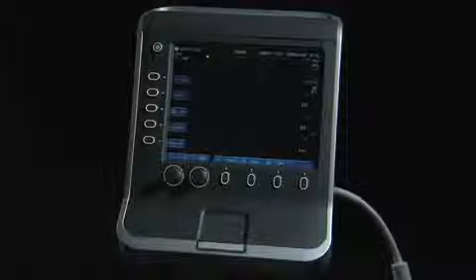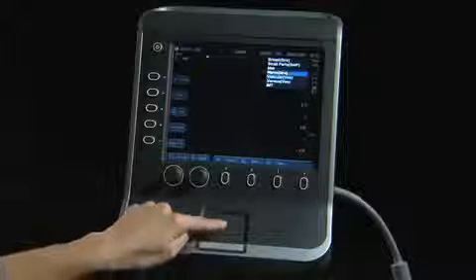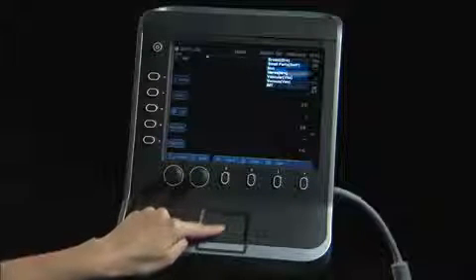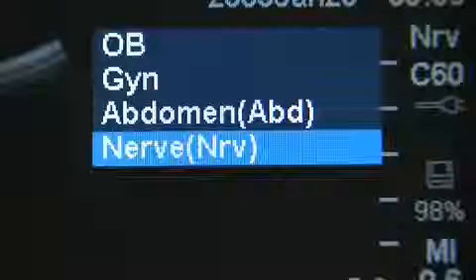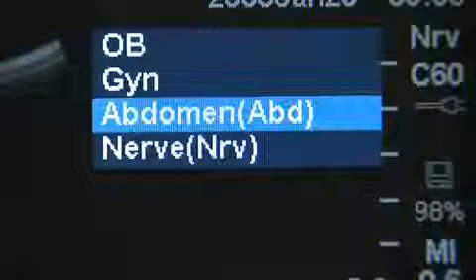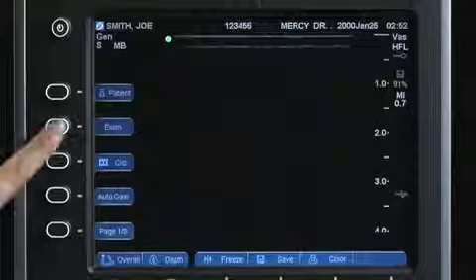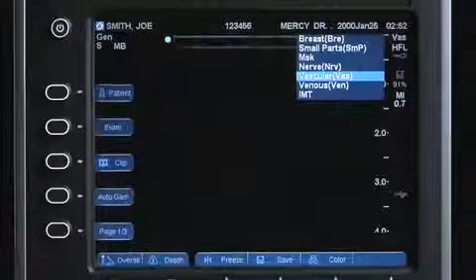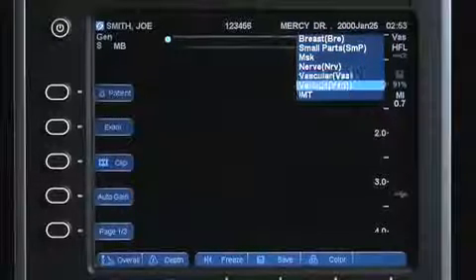The exam key can be selected during a patient exam to quickly change exam types without having to return to the patient data entry screen. The Exam Types menu lists the exam types that are appropriate for the transducer selected. Selecting the appropriate exam type ensures that system parameters have been adjusted for optimal viewing of the structure of interest.